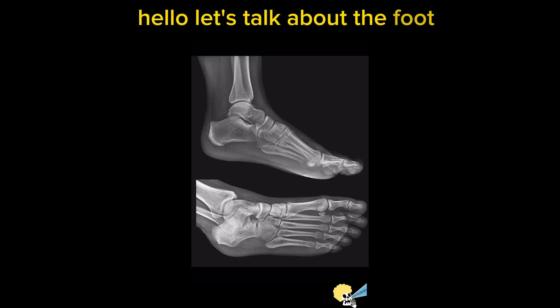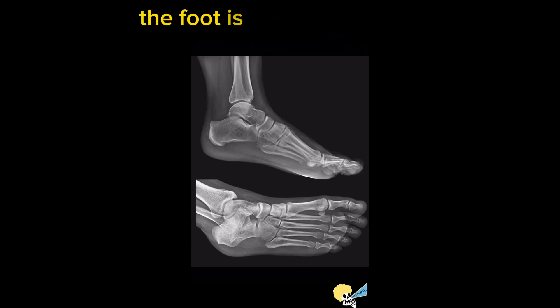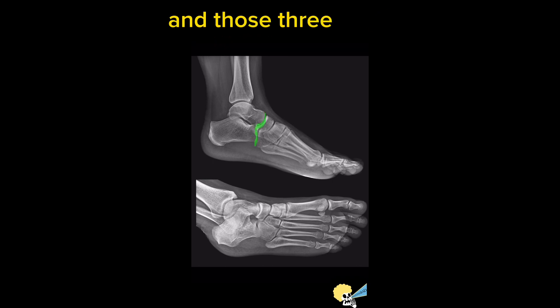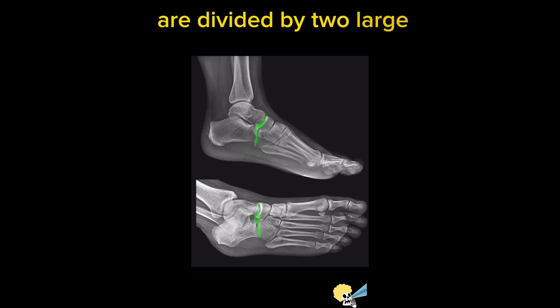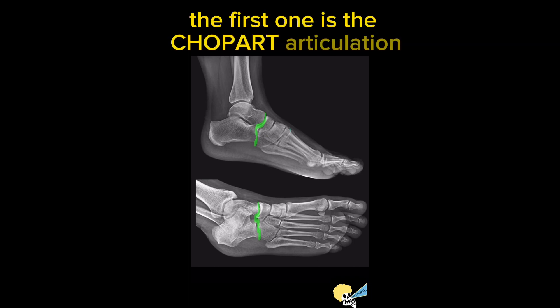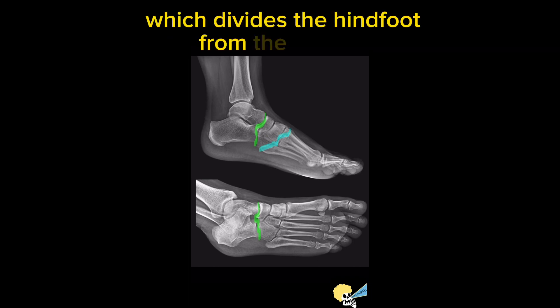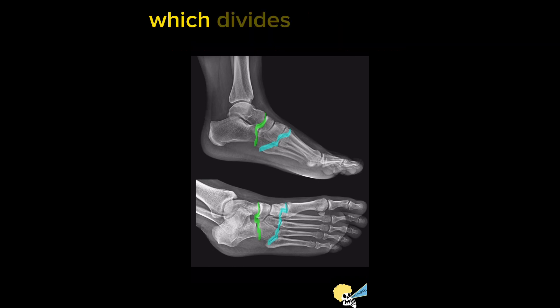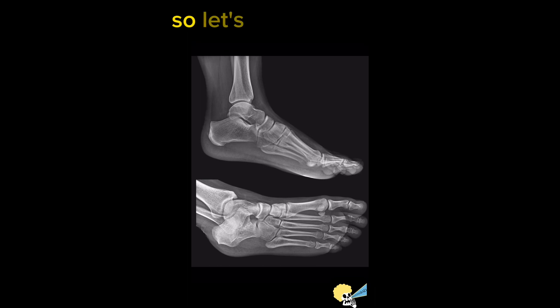Let's talk about foot X-ray anatomy. The foot is divided into three major sections, divided by two large articulations. The first is the Chopart articulation, which divides the hind foot from the mid foot, and the second is the Lisfranc articulation, which divides the mid foot from the forefoot.